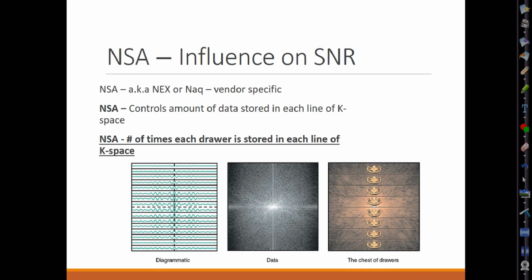So we've covered the parameters that influence image contrast, but they also influence image quality, which were your TR, TE, and flip angle. Remember, we talked in Unit 2 about how TR and TE give you desired image weightings, and that's also considered contrast. Now we're just going back to our extrinsic parameters that are really just dealing with signal.